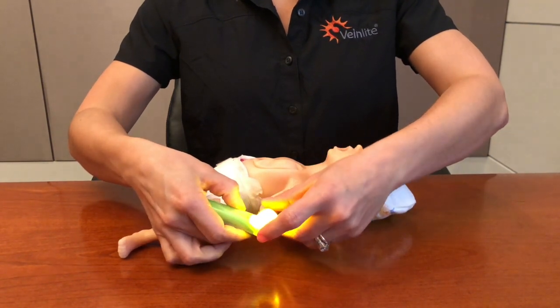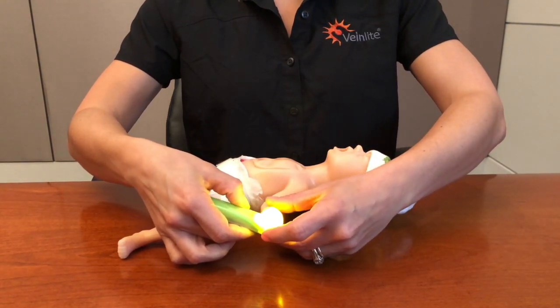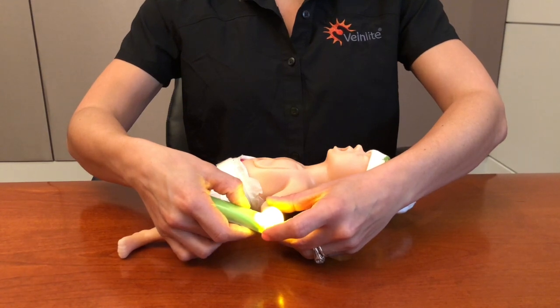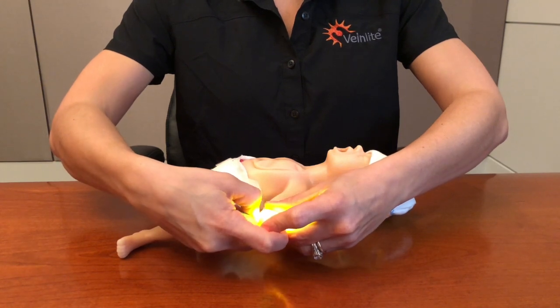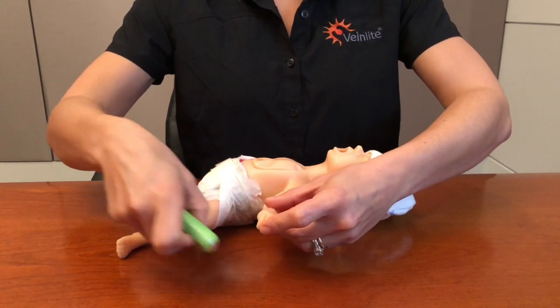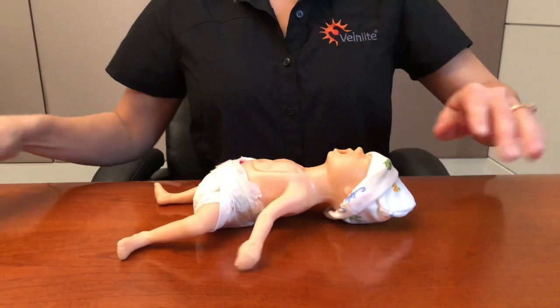Once access is complete, turn the device off, then remove the Neo away from the patient, and dispose of the one-time use cover. That is it! To learn more or to place an order, please visit our website at www.veinlight.com.